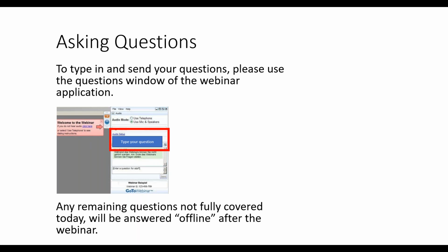Similar parameters would apply to the 810 wavelength. And then, as we know, sometimes this pathology requires retreatment. So it's not uncommon that we may need to treat two or three times to achieve complete resolution or even reduction of subretinal fluid.